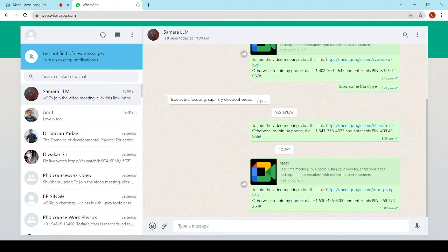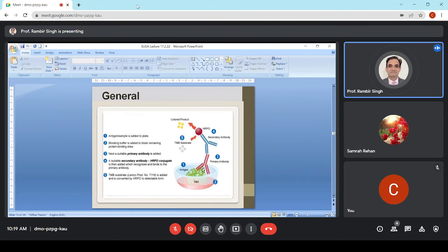If the person has an infection of the organism having this antigen, then this antibody will be present in the human blood, and it will bind to the antigen. But there will also be many unbound antibodies, so we wash the well so that all unbound antibodies are removed. So we only have the bound antibody, right?